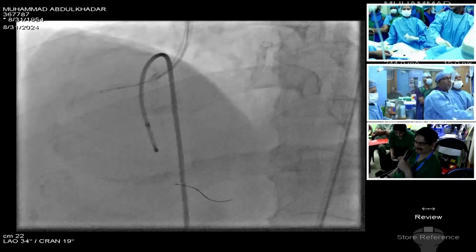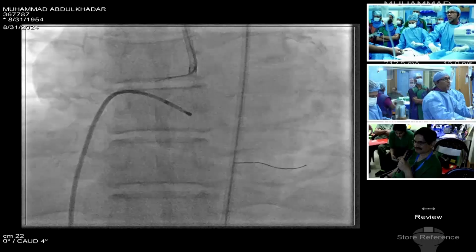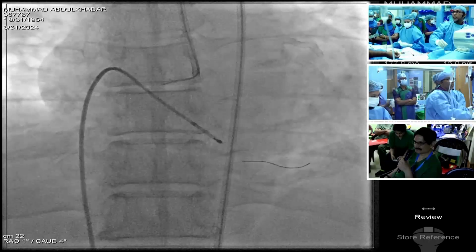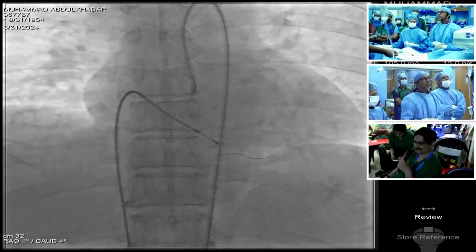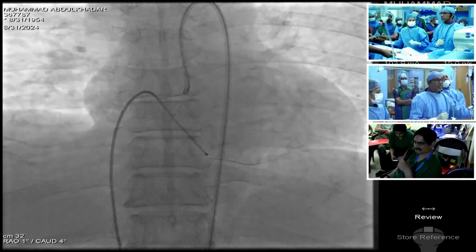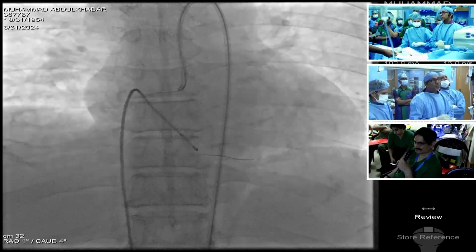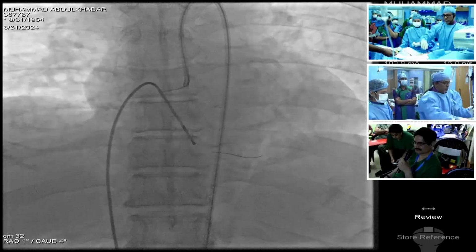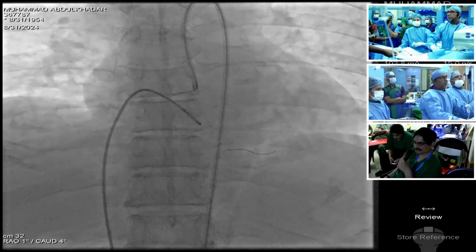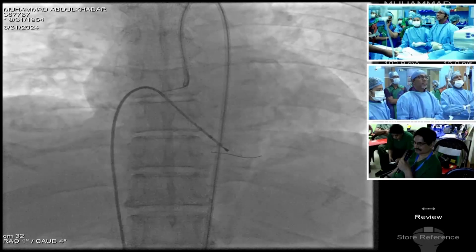Come to AP view. Come to AP view. Show the pacemaker wire. Okay. Now do the okay. Keep it at 100. Okay.